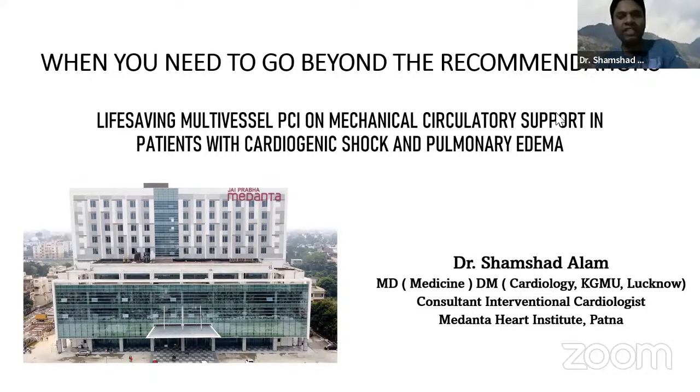So I am presenting two cases in cardiogenic shock. At times, it is a recommendation that in cardiogenic shock you need to do culprit vessel PTCA only, and then wait for some time and do a staged procedure to the other vessel.